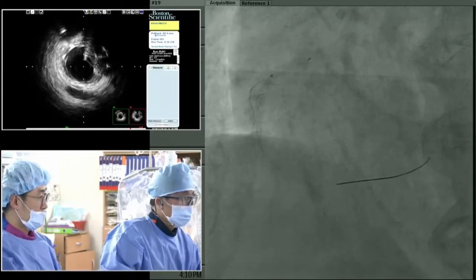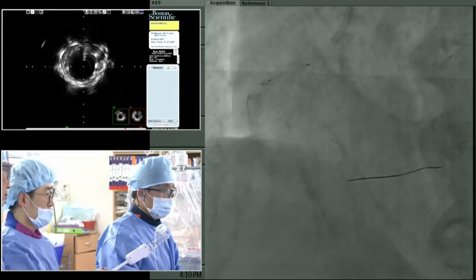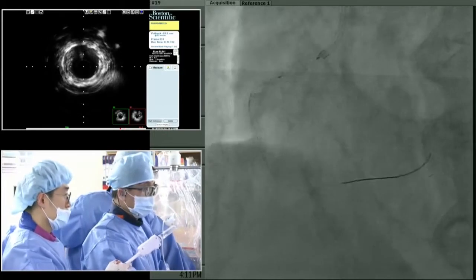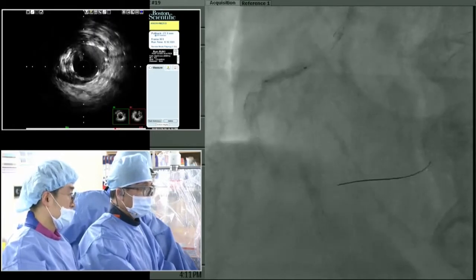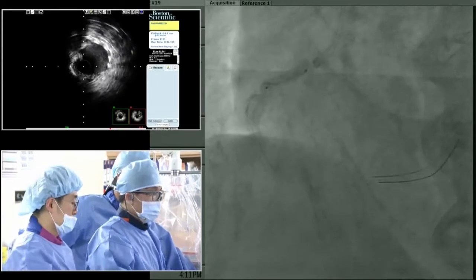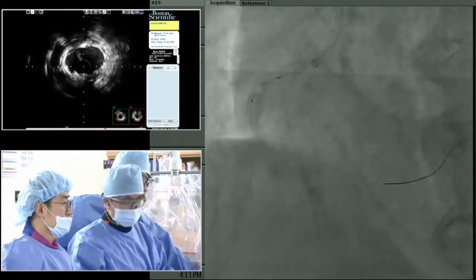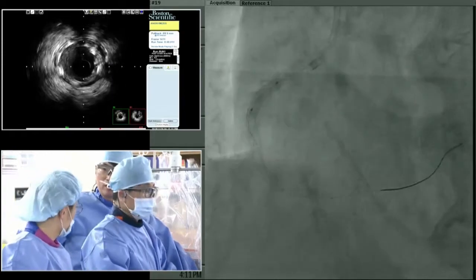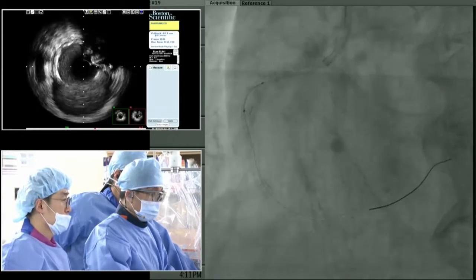Okay, I feel some resistance. I'll do the anchoring technique. Please hold here now. Okay, go. 10, 12. Still guide line inside? No. Okay, deflation. And push in. Okay. Great. Okay, 10, 12. Okay, 20. Okay, 20, deflation. Push slowly. Slowly. Gradual.